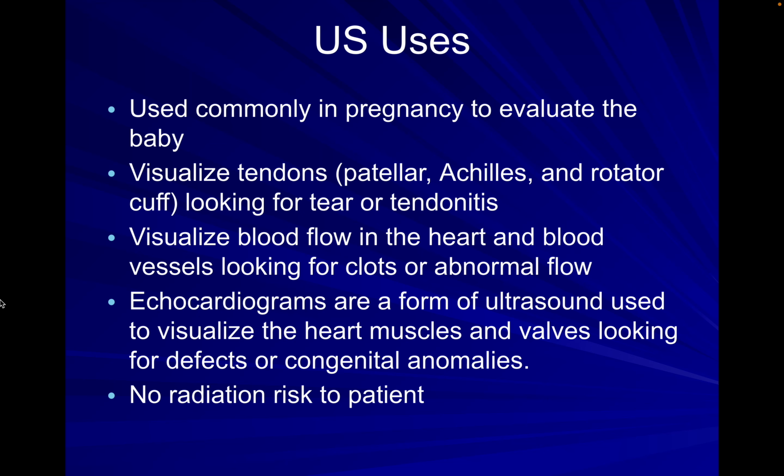But now we're finding much more application for looking at tendons to see if there's any tearing or tendinitis, looking at blood flow, heart function, like an echocardiogram, which uses ultrasound technology, and then even looking at internal organs for signs of bleeding, to look for fluid backup, to look for collections of infection, and several other applications.